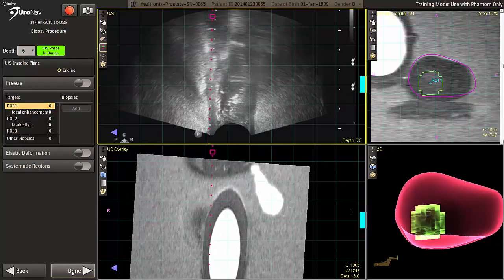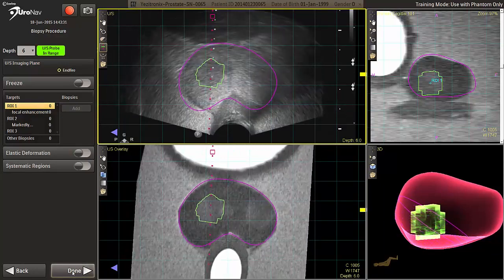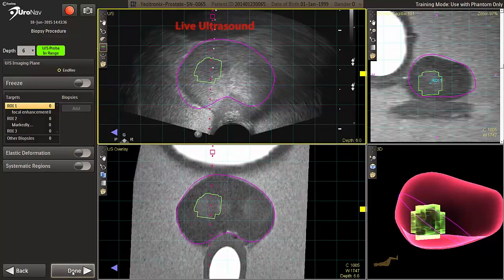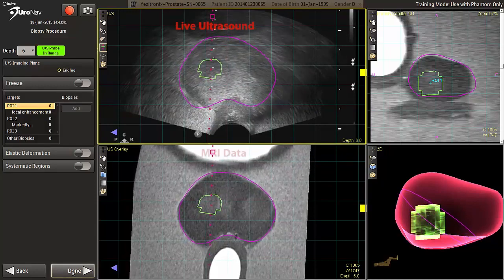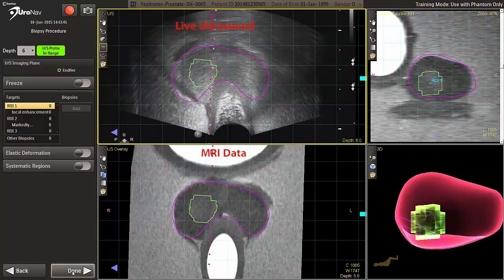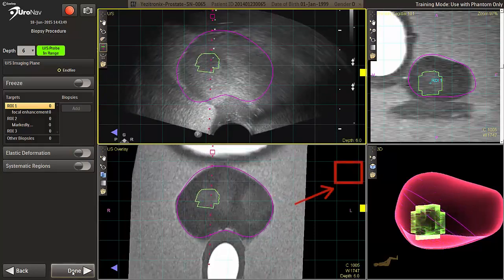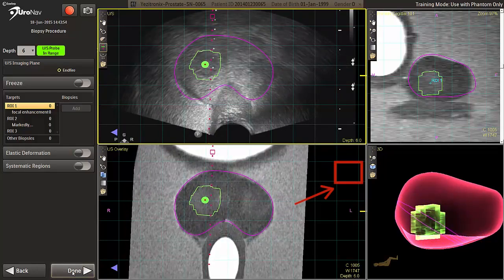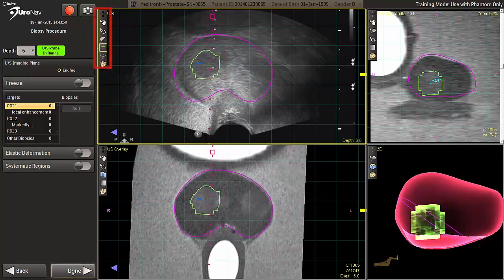On the biopsy navigation screen, users will fine-tune and reconfirm their registration adjustments in two planes before taking biopsies. The live ultrasound on the top screen, overlaid with the pink MR outline, is simultaneously viewed with the source MRI data on the bottom. The one centimeter cubed grid boxes are used in addition to keeping the pink MR outline in check through the use of internal fiducial markers or structures that can be seen on both ultrasound and MR. Tools such as pan and rotate remain on the toolbar.